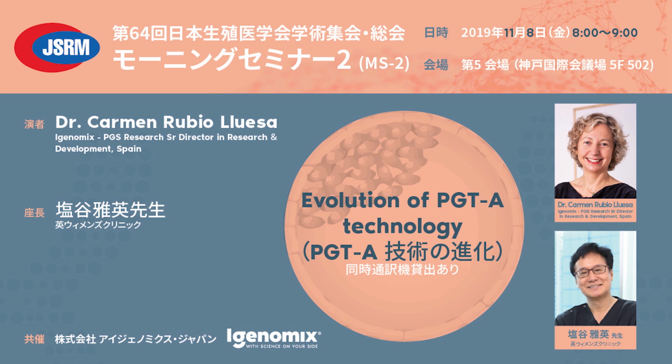I want to ask you, how can you distinguish mosaicism by this procedure? Okay, this is a very good question. We were thinking a lot about mosaicism and the analysis of the media. And we were checking the results considering 30%, 40%, 50% mosaicism levels. And there is a recent paper by Catherine Rakowski, also working with this, and I'm glad that we reached the same conclusions. If you consider mosaicism at low levels, the concordance results are very low.